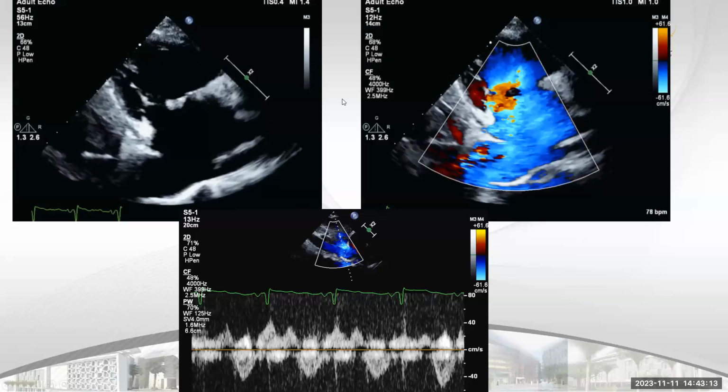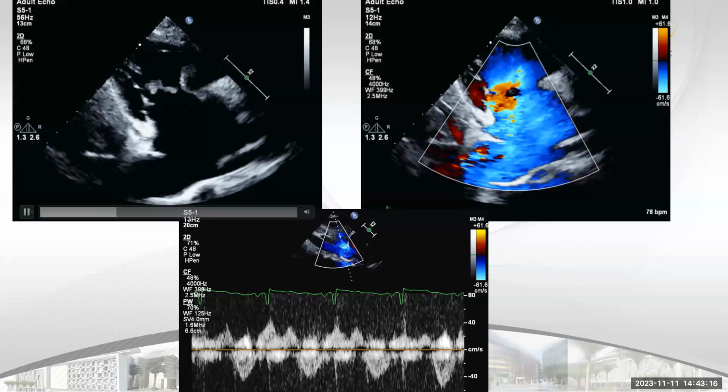Let's see. This is one answer. Severity of regurgitation, hepatic flow versus severity of the... You know, endocarditis, I think, is not in the coding sheet, because endocarditis at the end is just a summation of clinical, pathological, radiographic and echo examination. Severe MR, oh my God. Severity of TR, vegetation, dilated RA, dilated IVC. So I need 4 answers from the coding.